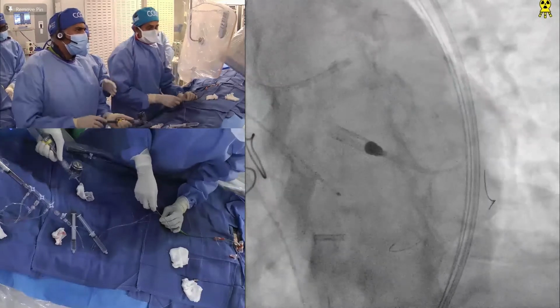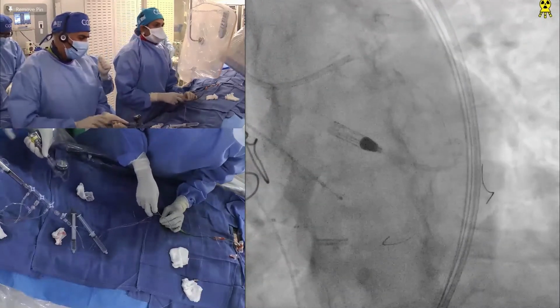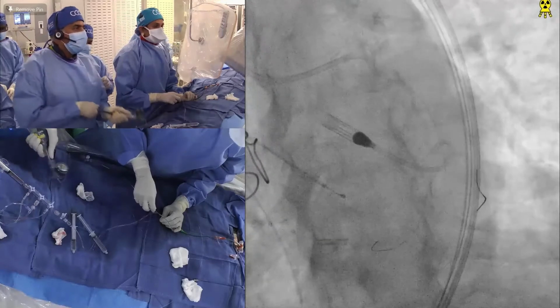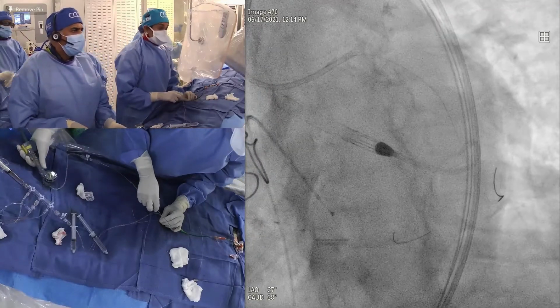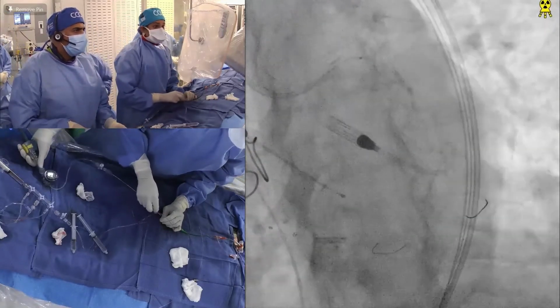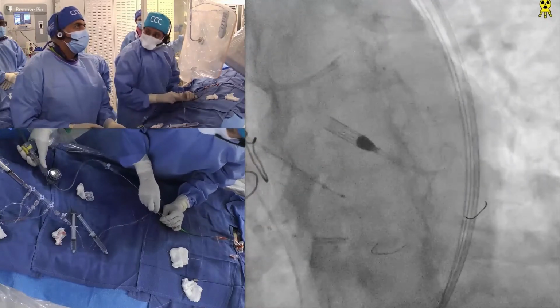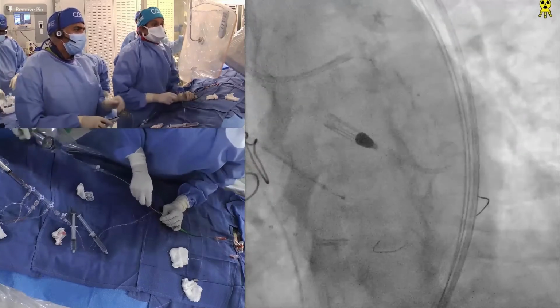So what happened is, in the guide, you go high pressure. So basically, now your blood pressure will become flat, negative. So basically, you are done. Remember, all balloons come with the additional attachment. 2.5 12 balloon. Okay. I think we didn't rota in there.